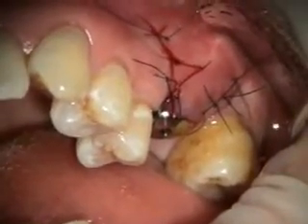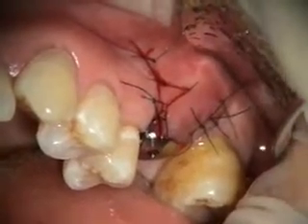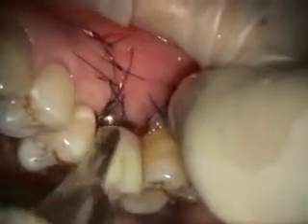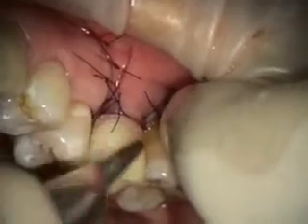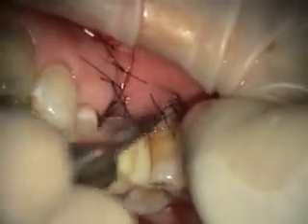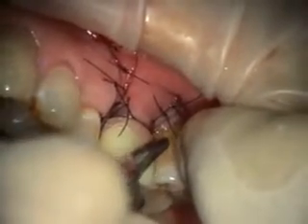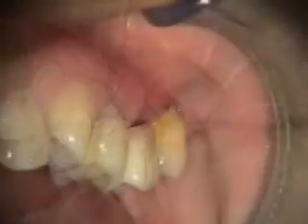So we've got our implant in, we've got that ridge augmented on the facial, and we're going to adjust her stay plate. The stay plate had some wires on it — one wire that had two clasps and it went right over the healing abutment, plus it had a flange that went all the way down in here. You can see we've augmented all that, so we've taken the flange off. I may end up needing to put some little wings on here for retention, but for now she'll just have to put some adhesive on the inside.